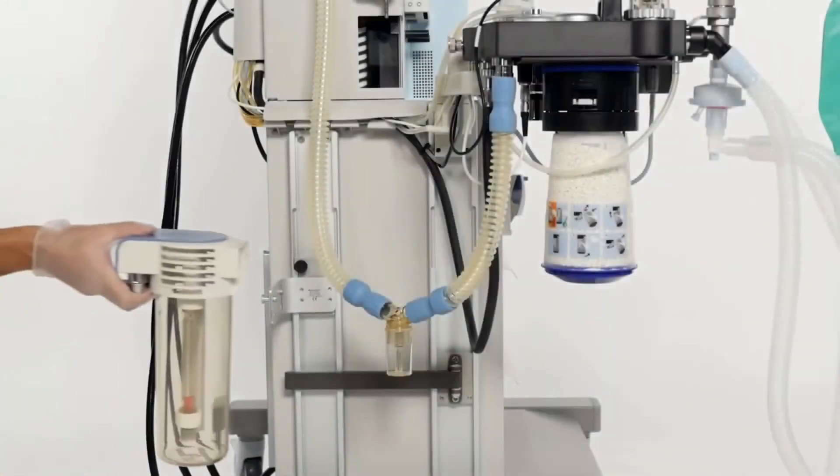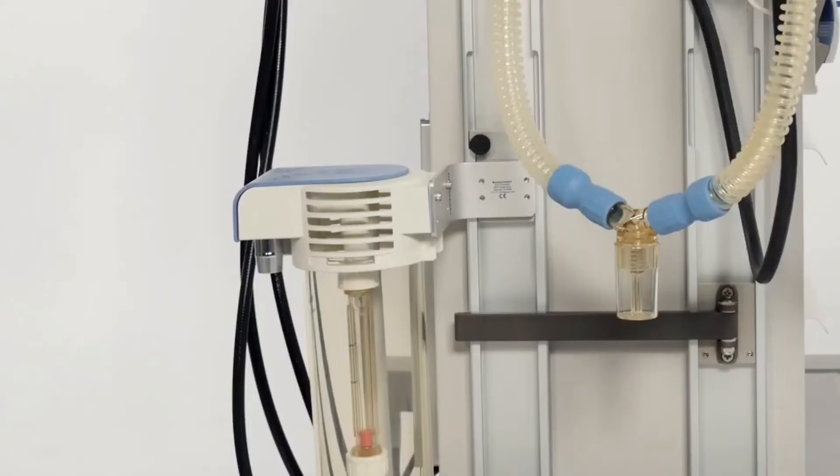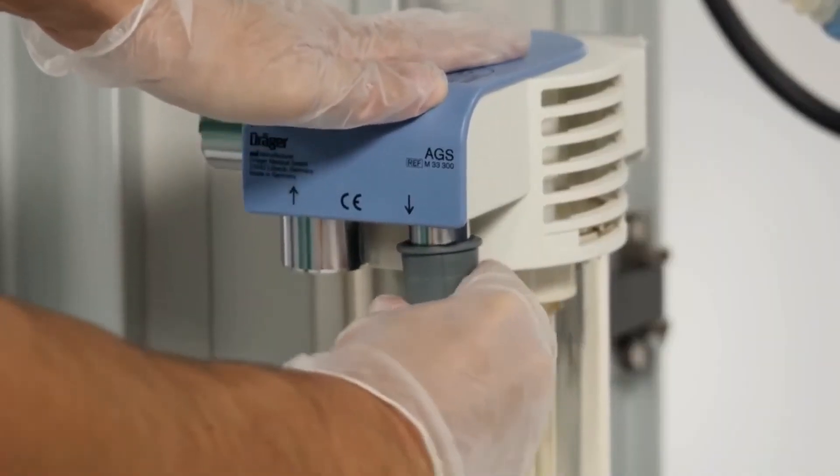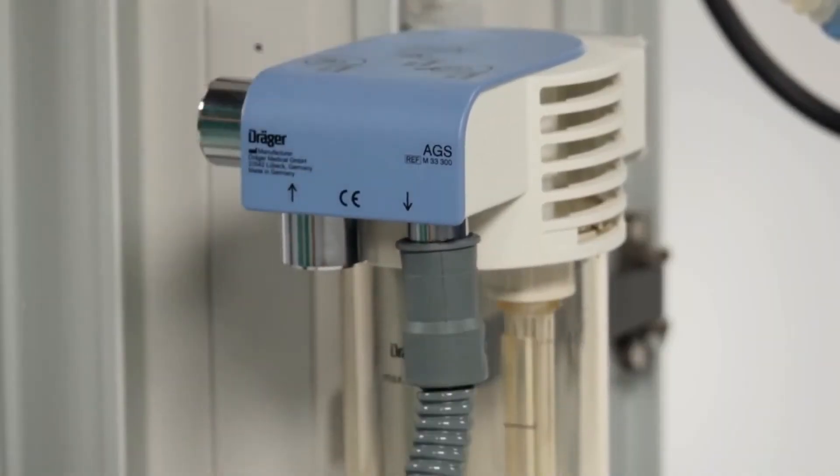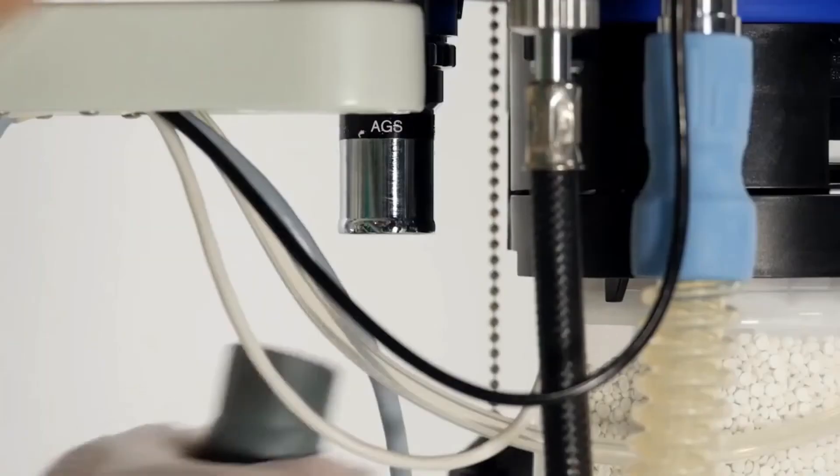For the assembly of the anaesthetic gas scavenging system, hook the receiving system into place on the rear side of the Fabius. Connect the scavenging hose from the receiving system to the central disposal system. Then connect the transfer hose between the breathing system and the receiving unit.